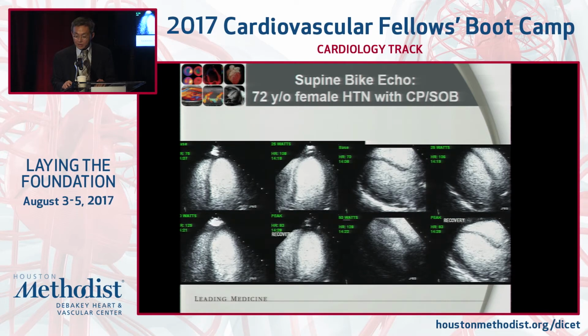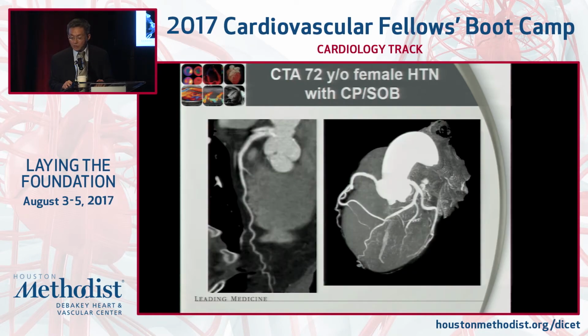Again, I apologize, it's not playing. This is a patient with 1 or 2 segments of abnormal exercise echo. We went to the CTA, showing that she has some underlying arteriosclerosis, but no obstructive disease in the LAD, which is where the abnormality was seen.